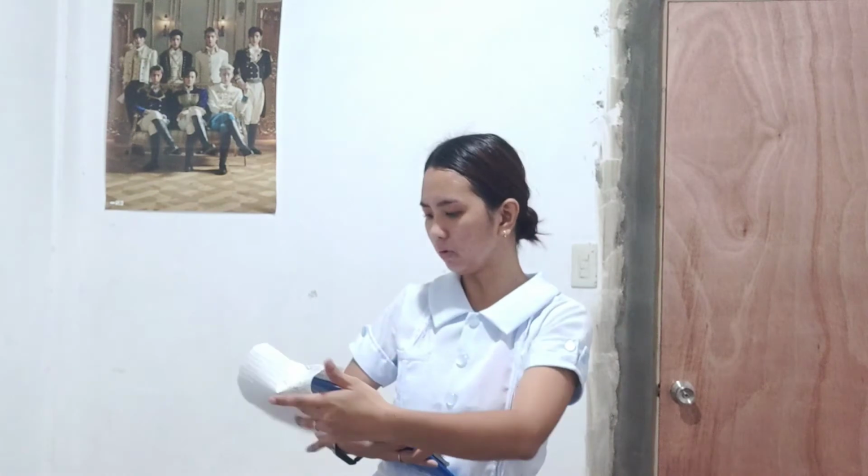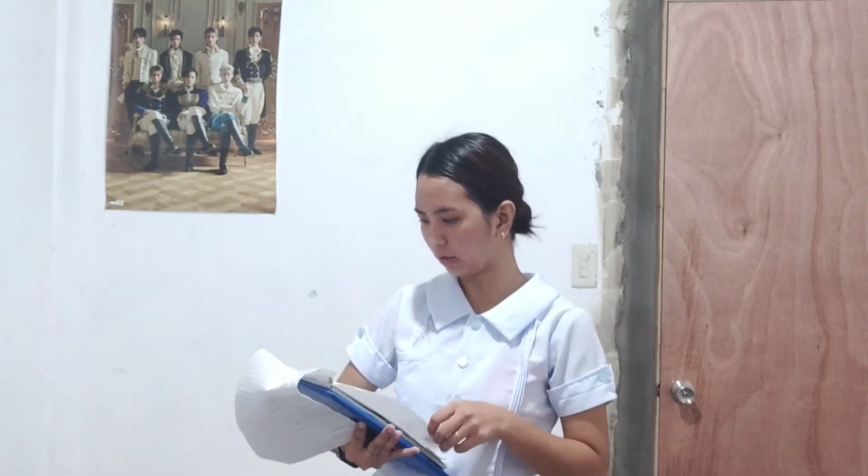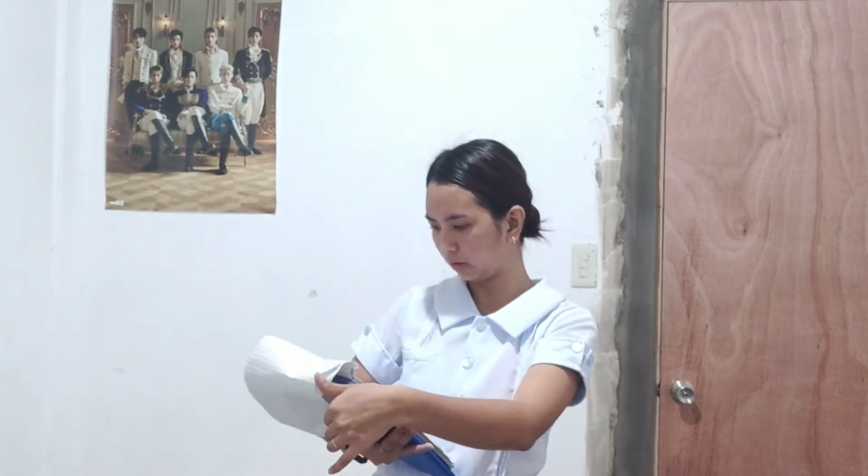First, we're going to review the physician order and medication record for the medication to be given. So we will review the medication record and the physician order. Okay, after that, we will determine the materials that we need for the order. So I need a 5cc syringe, an ampule, and a cotton pad. Next, I am going to do the hand washing.